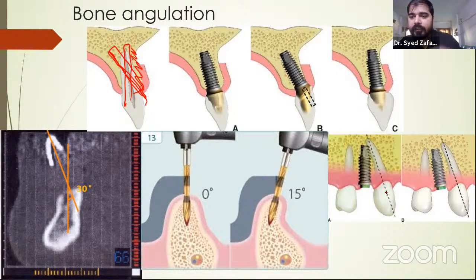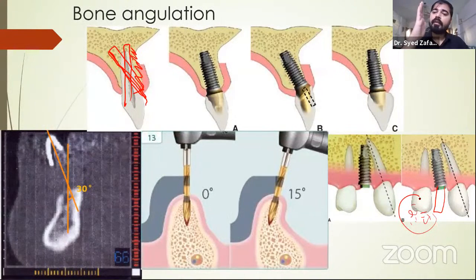If the tooth is displaced, then what will you have to plan? You can place the implant a little bit tilted like this. Now we have abutments with 15-degree and 25-degree angulation. Now abutment verification has also occurred. But mostly things are assessed in OPGs. If you are placing an implant straight, but the tooth is displaced, you have to tilt it a little bit. Why? Because if you drill, the tooth will also be affected.